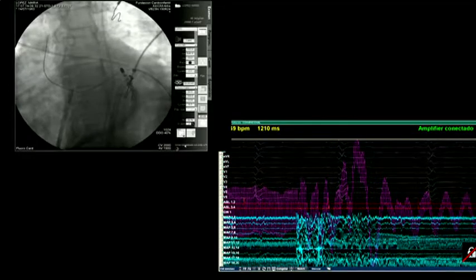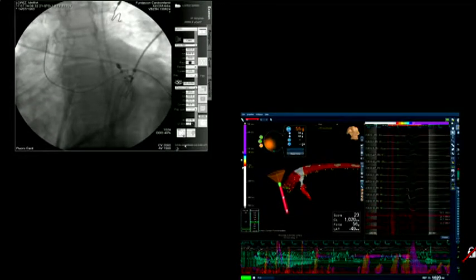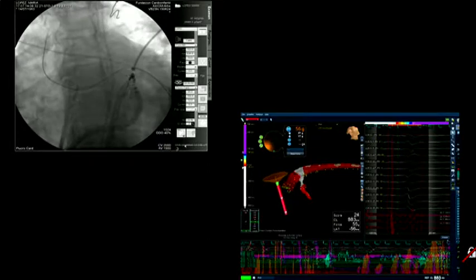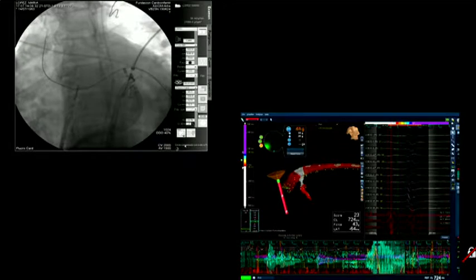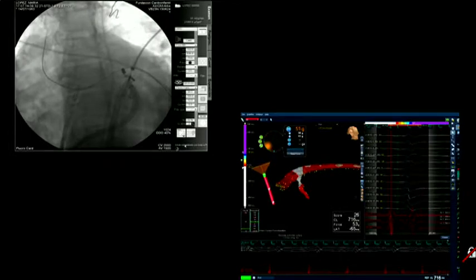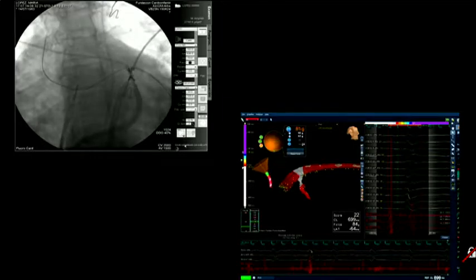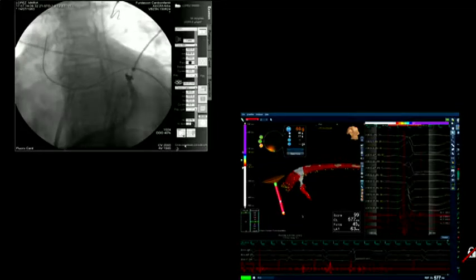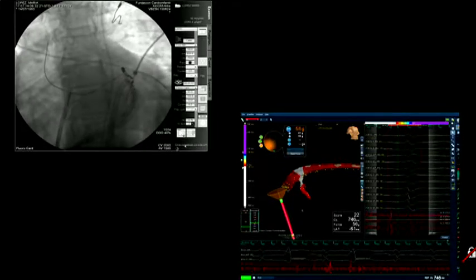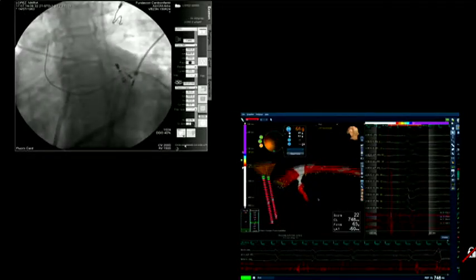The ablation catheter is very proximal still. It's going to be very difficult to get there, even with the Agilis as we have placed it. We have opened another ablation catheter just in case. In the map that we're seeing, the 3D map, I think that you finally marked the earliest area, right? On the arrival of the interventricular to the great cardiac vein, which is close to the outlet of that most basal perforating. Yes, yes. We see a very significant angle here. It's quite an acute angle.